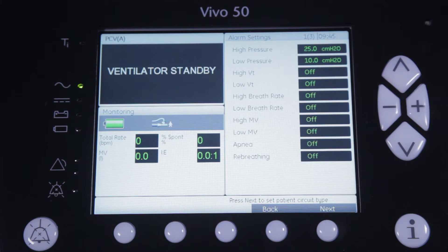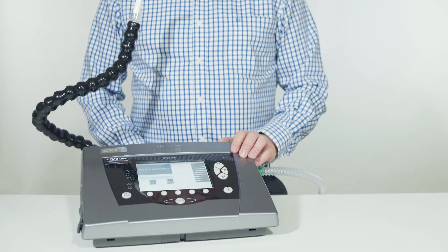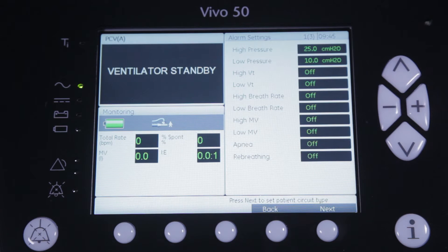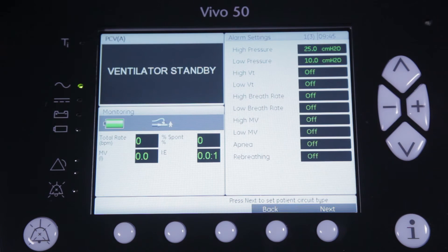Where you can select which alarms you want to use to make sure your patient is treated in a safe and efficient way. As you can see, most of the alarms have been turned to off as a default for mouthpiece ventilation. You can either choose to leave it like this or decide to activate one or more of the alarms.